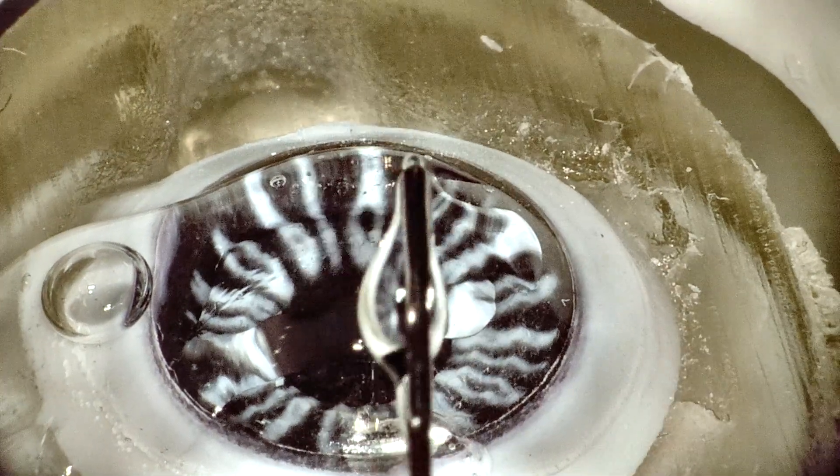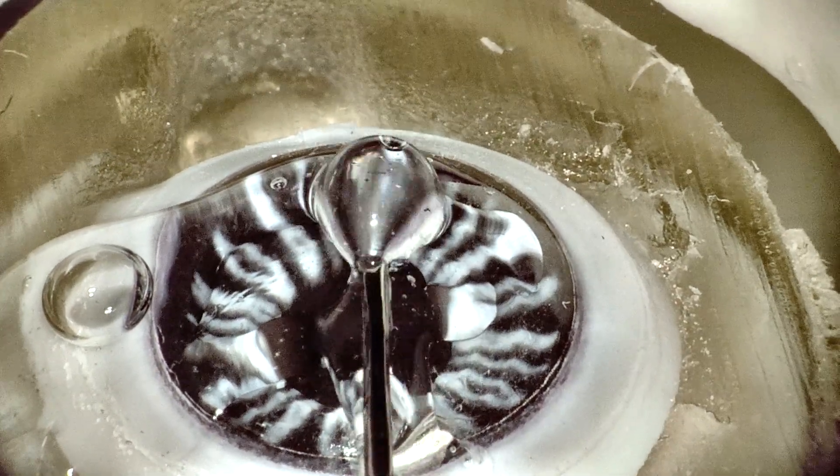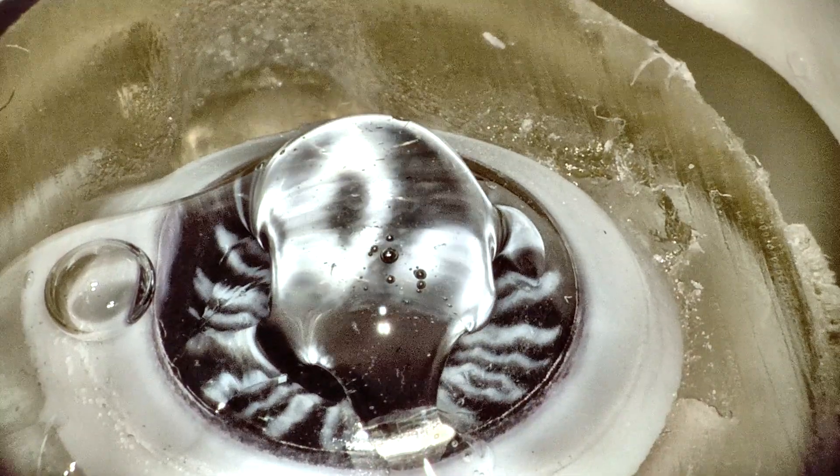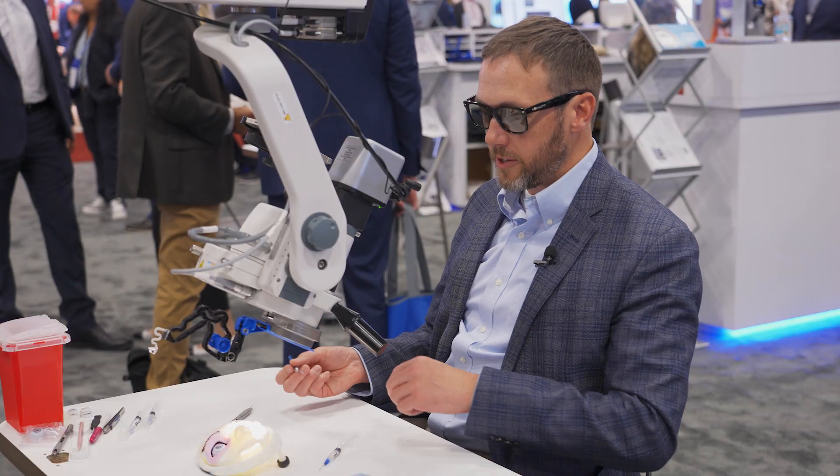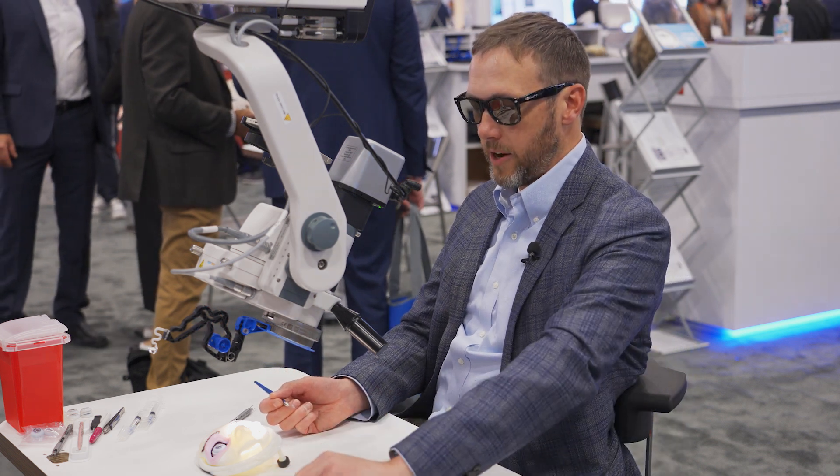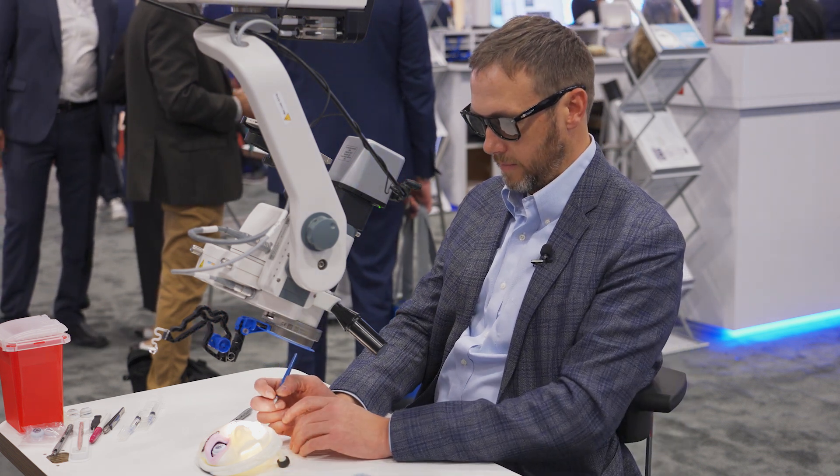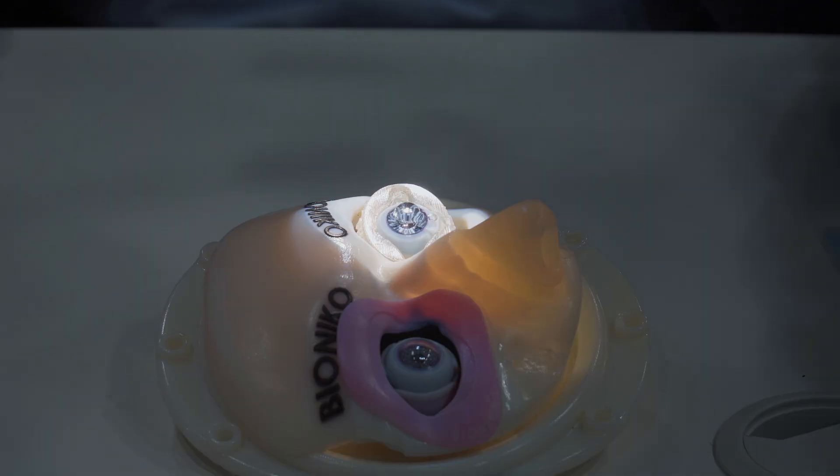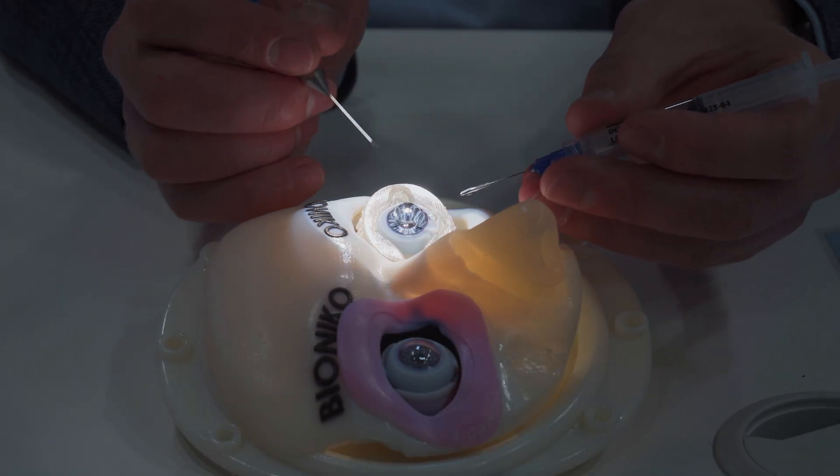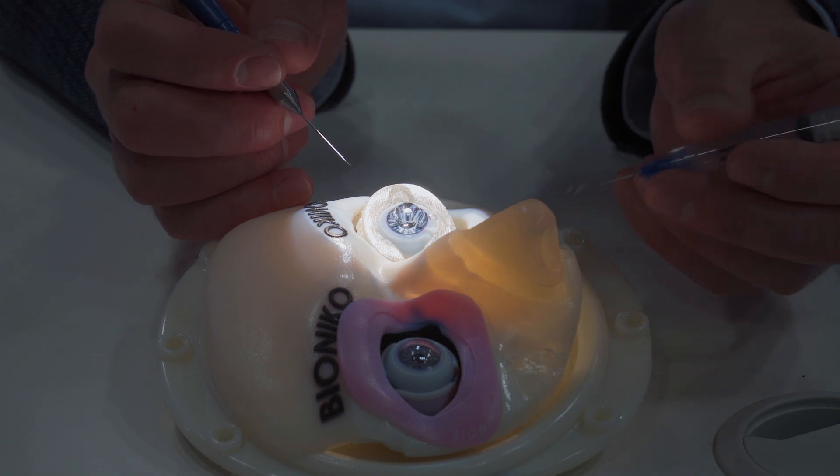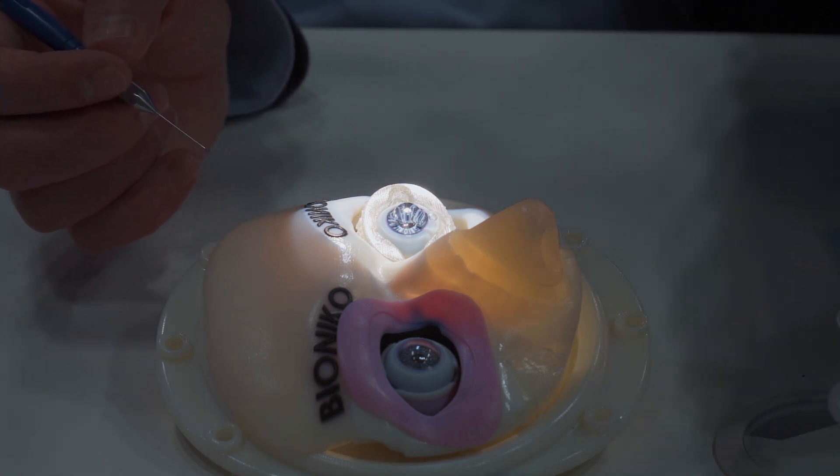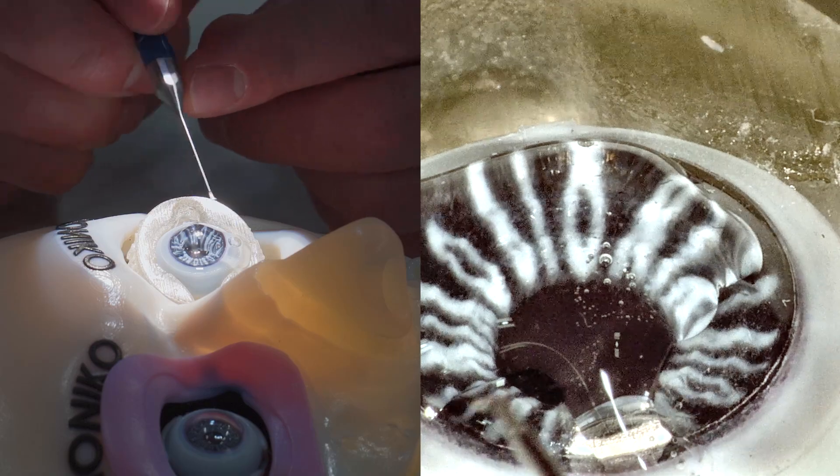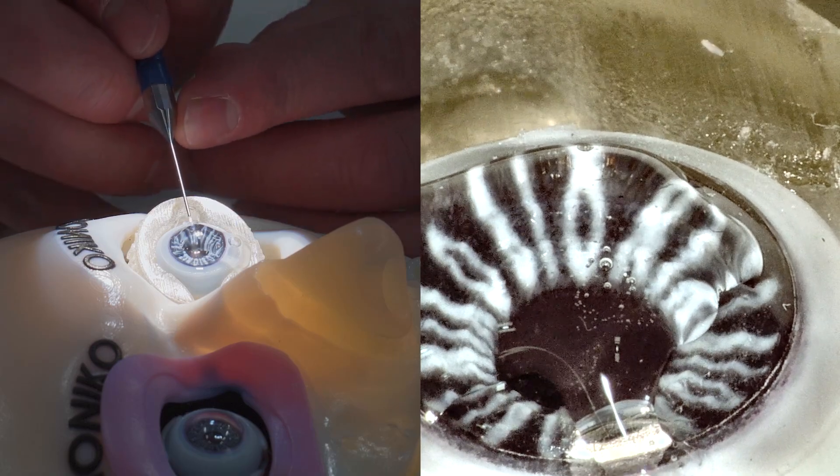We'll put a little more viscoelastic right on the cornea here, and then whatever instrument you're using—in this case the KDB glide—we're going to grab our instrument. What I like to do sometimes with this, since we have two hands, is you can use your second instrument just like you would during a phaco and put it through a paracentesis wound. That can help stabilize the eye. We're going to go in through our main incision here.